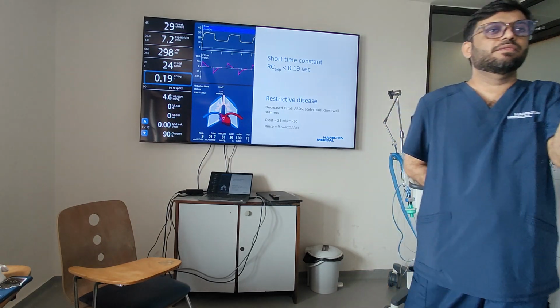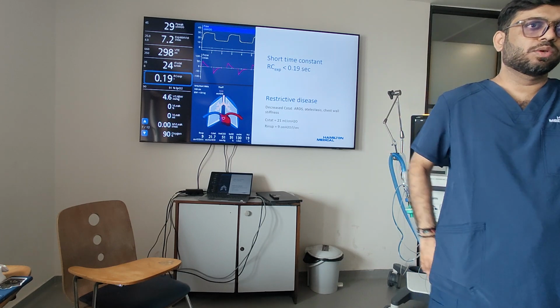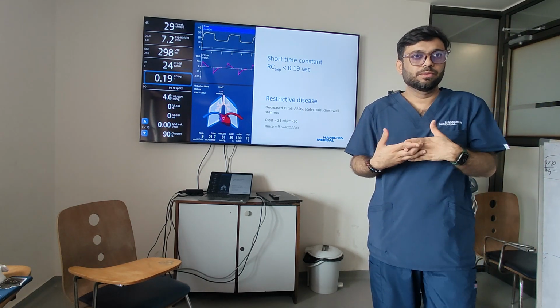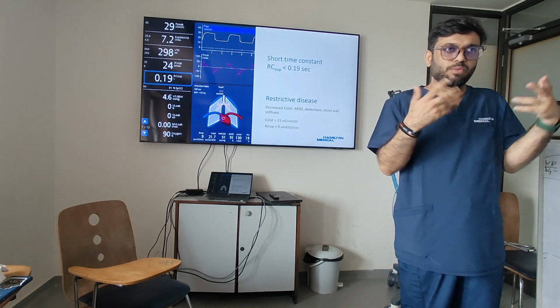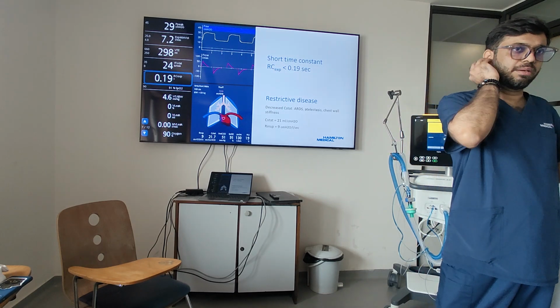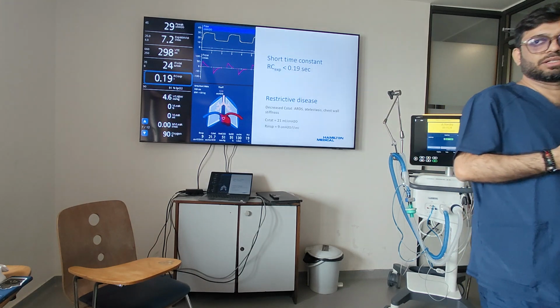Now, in this particular case, when you said that the ETCO2 was too low, in that case you can decrease the minute volume so that it normalizes the ETCO2. So we have to decrease the minute volume. Because if he's spontaneous and if he's generating good volume, and then the ETCO2 is too low. He was spontaneous at that time? No, it was passive. No, he was spontaneous.